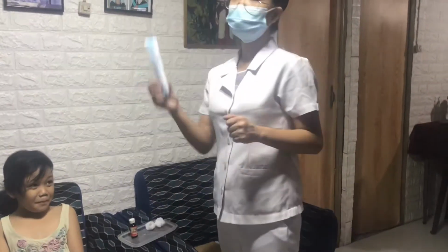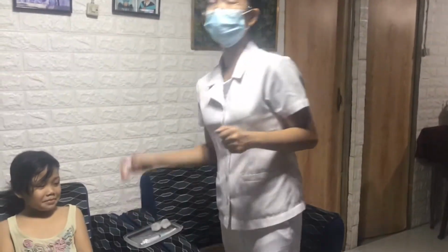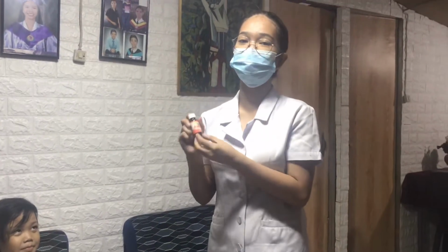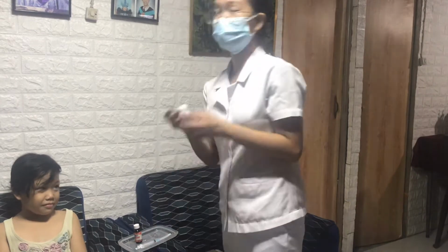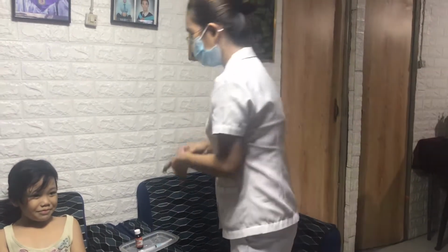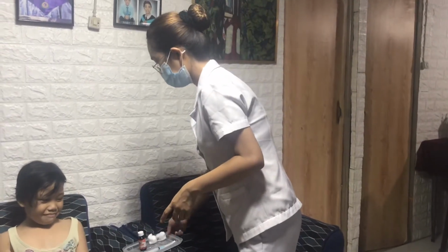First is the syringe. Let's pretend that this is a vial, and a cotton for the sanitation of the surface.